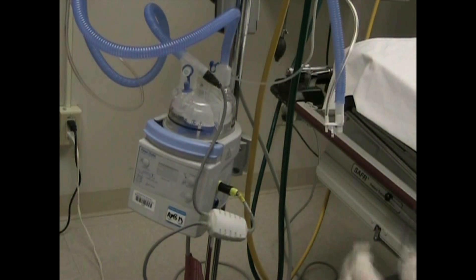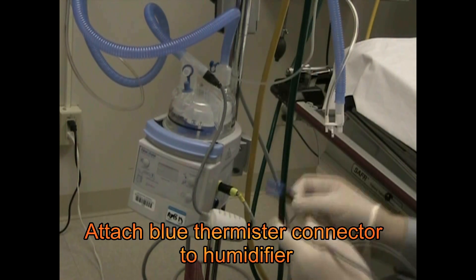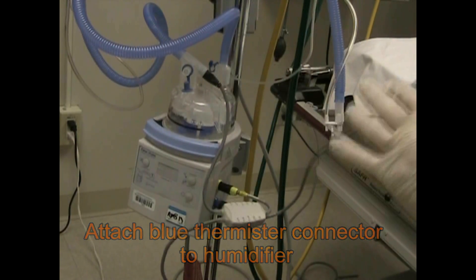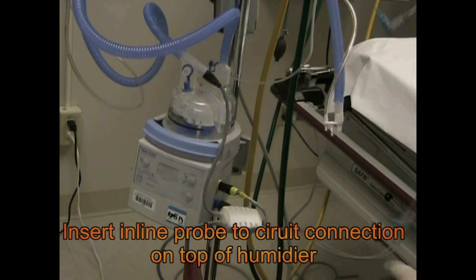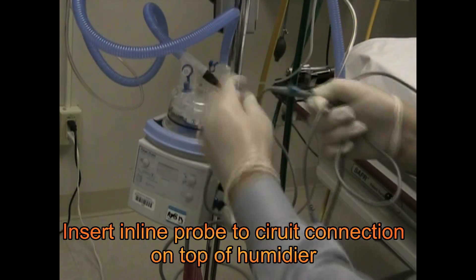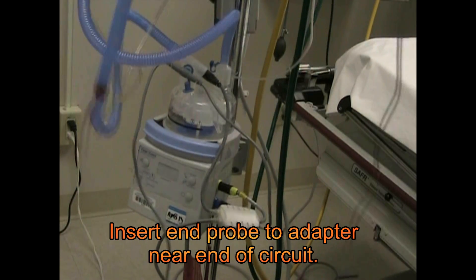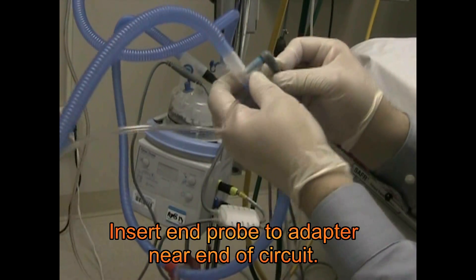Now we're going to take our heat temperature probe — it's blue — and it fits into this blue port right below the heated wire port. It fits in and snaps in, and you can see there's a temperature probe here that fits into our circuit. You line it up because there's an arrow here that lines up with the arrow on the circuit to make sure it goes in correctly. Then we're going to take our inspiratory line and hook up the last temperature probe into the inspiratory line.